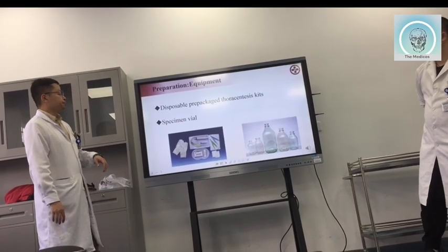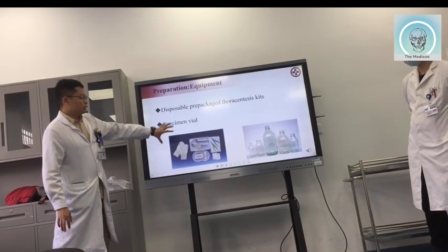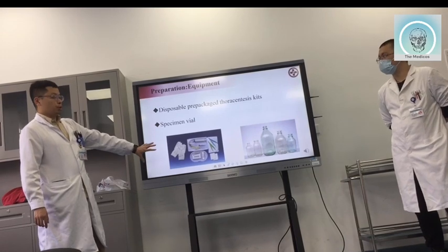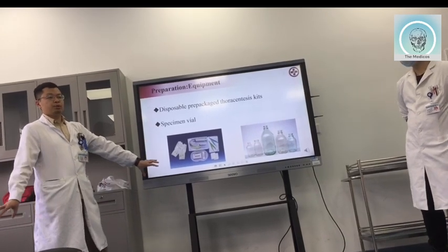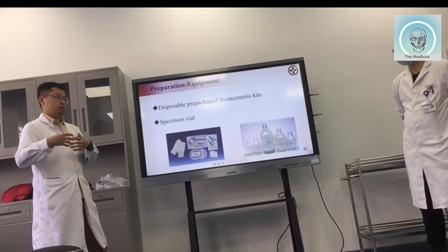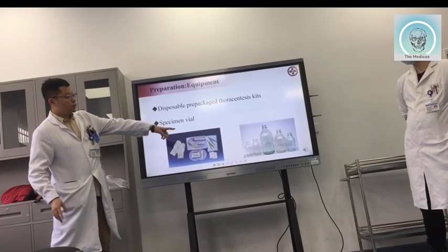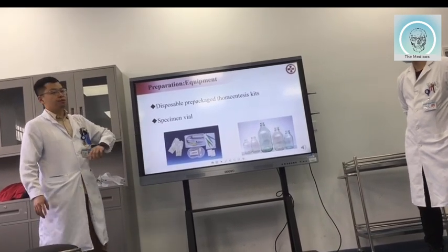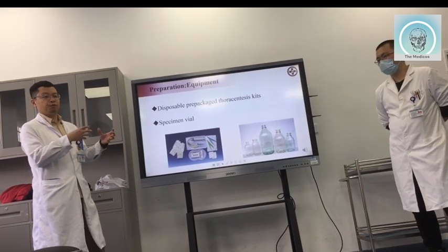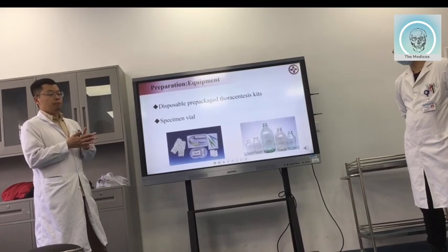Okay. So equipment, we have this kind of things. First, this kit, we use this disposable kit. But once you go back to your country, maybe it's not disposable. You just clean and use it many times, that's okay. And this one, the vial, that's for the specimen or for the collection of the fluid. Then you will take it to the pathology department.